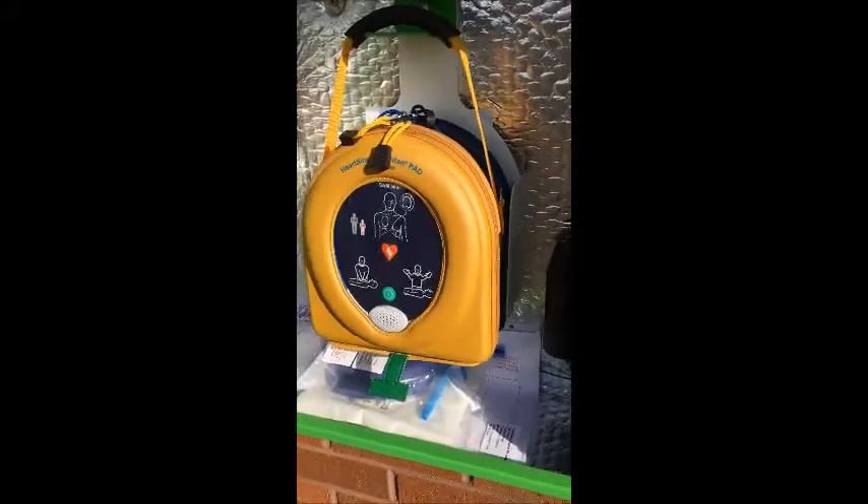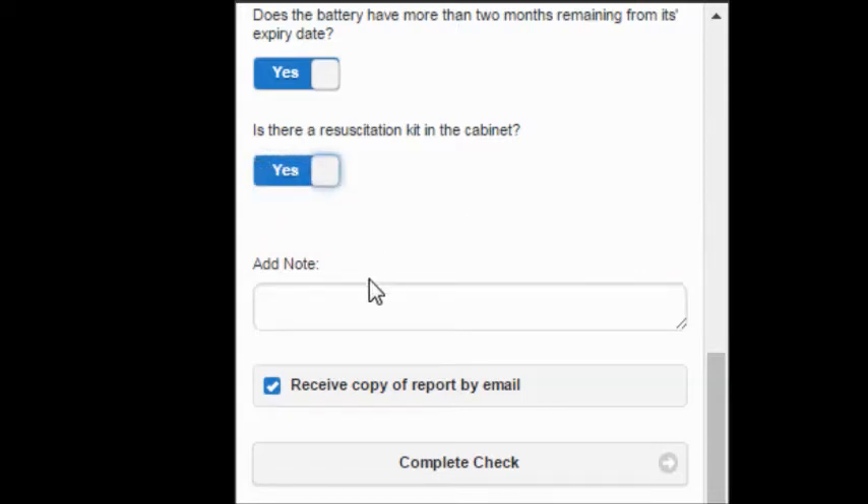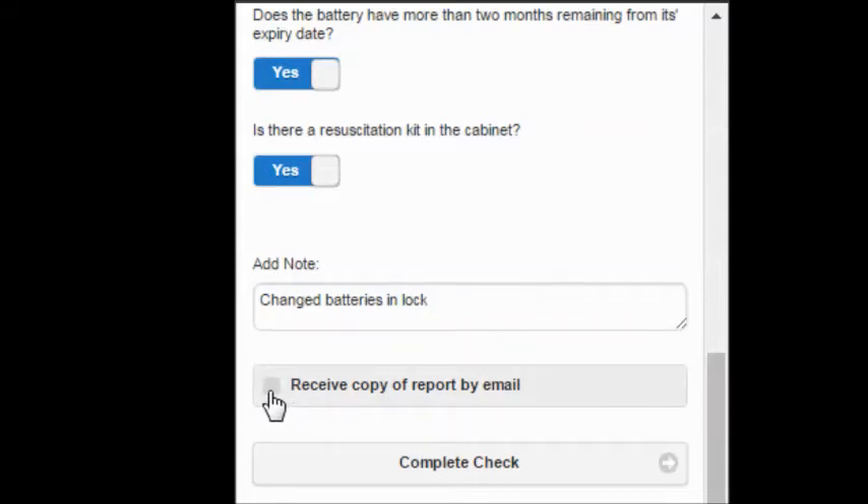The final question is: is there a resuscitation kit in the cabinet? You can see clearly there is a resus kit in here. If you've answered no to any checklist question, you'll see a red note asking you to provide more information. As there is a resuscitation kit in the cabinet, we can slide this to yes. In the note field, you can also send important information — for example, if you've changed the batteries in the lock. There's also a useful checkbox which will allow you to receive a copy of your report via email.